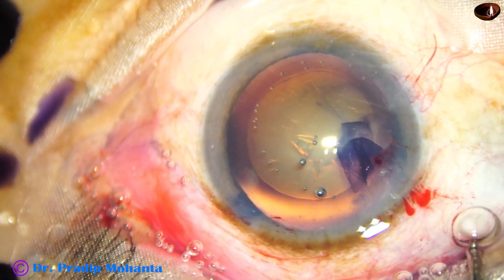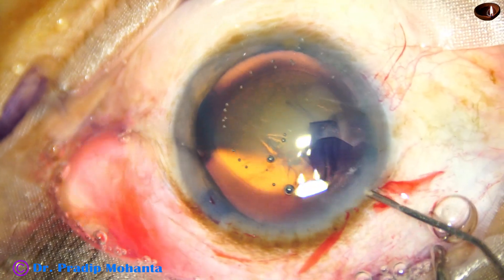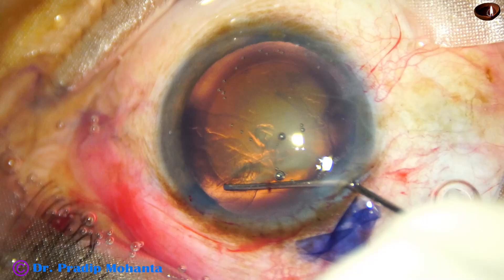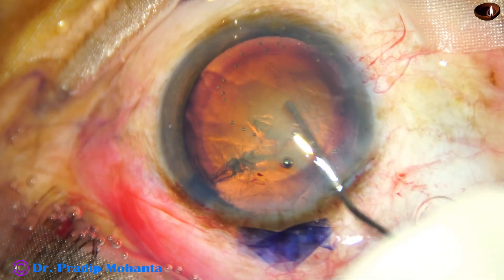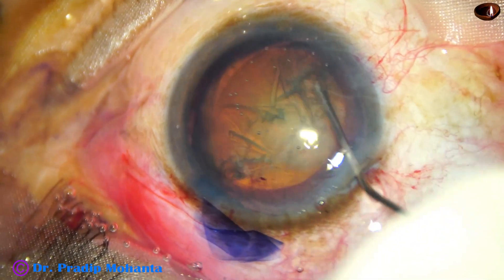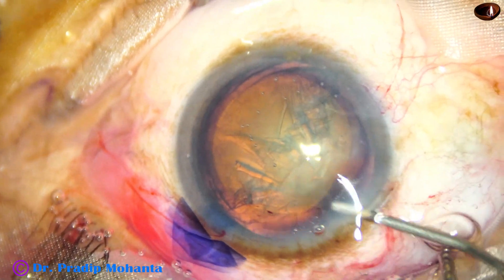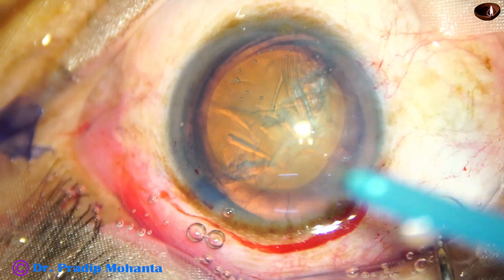Now hydrodissection. A 27-gauge cannula is taken; BSS is injected just under the anterior capsular rim. The nucleus is tapped and the nucleus is rotated.